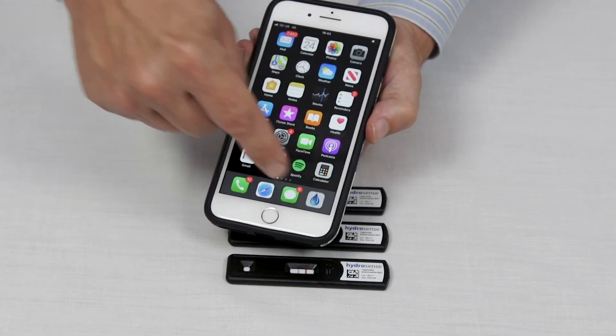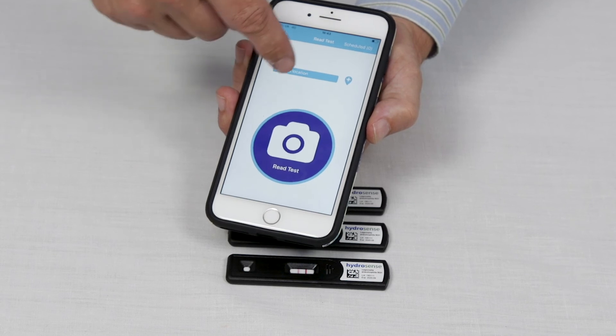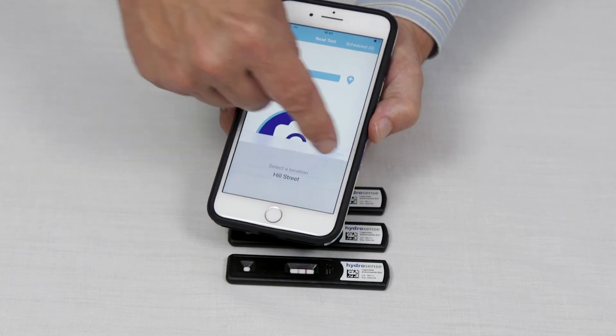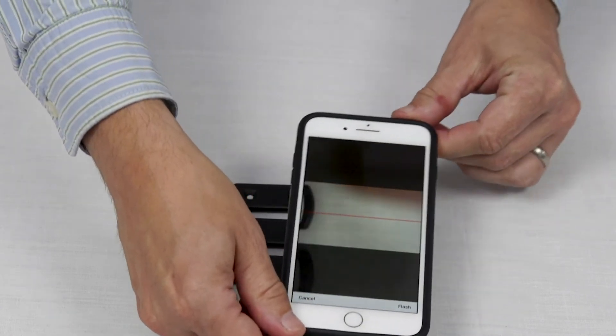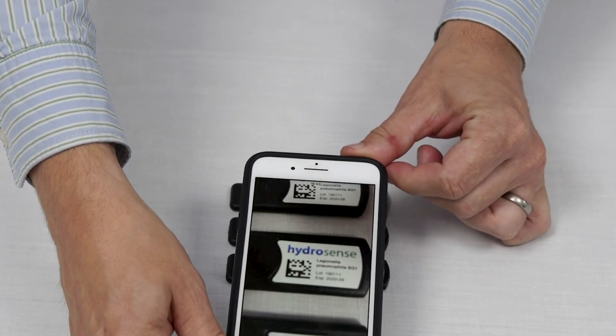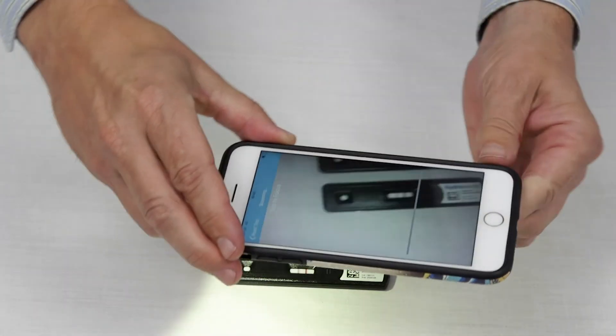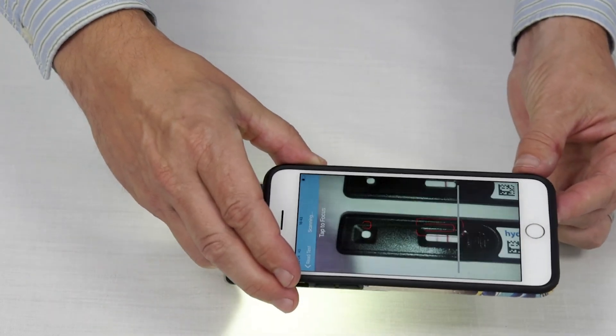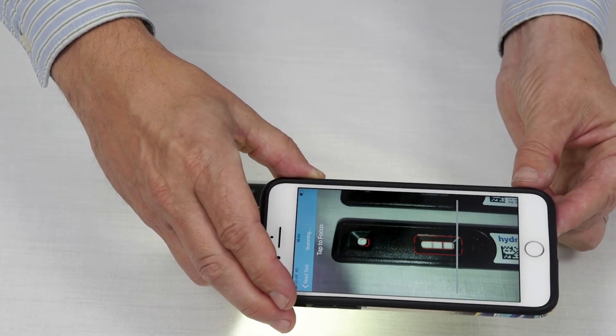To use the app, launch the app, select a pre-programmed location, and click read test. Scan the barcode, and then read the test by matching up the image on the screen with the cassette.